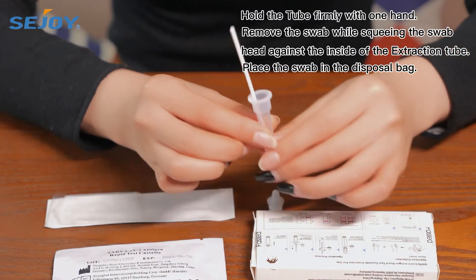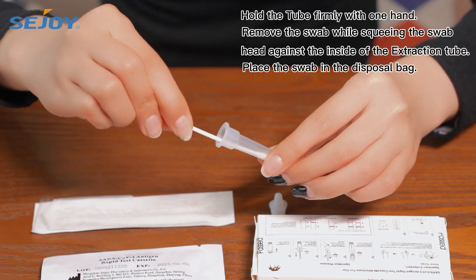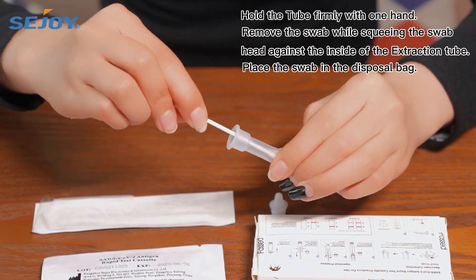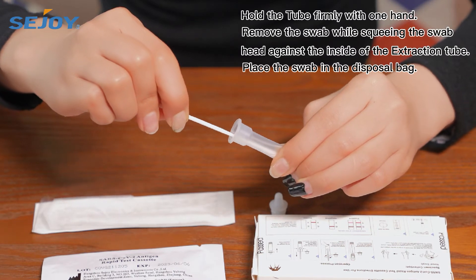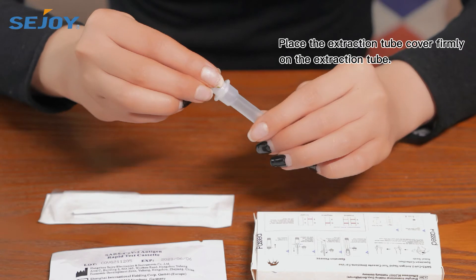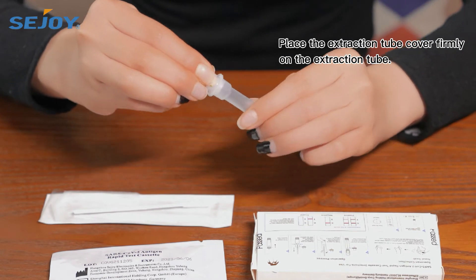Hold the tube firmly with one hand. Remove the swab while squeezing the swab head against the inside of the extraction tube. Place the extraction tube cover firmly on the extraction tube.